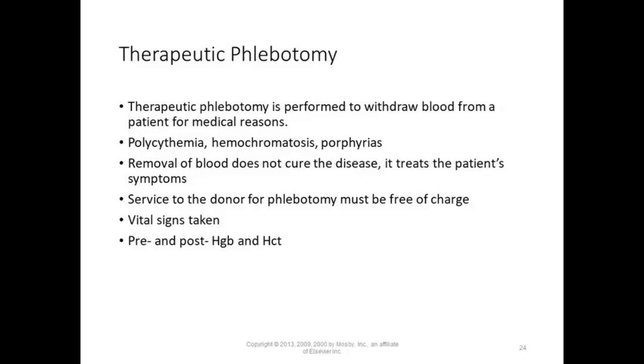So you're mainly focusing on ABO and Rh, and then each donor unit is screened for clinically significant antibodies.